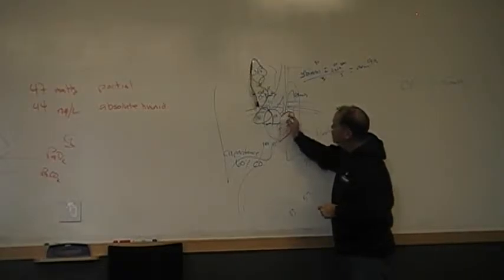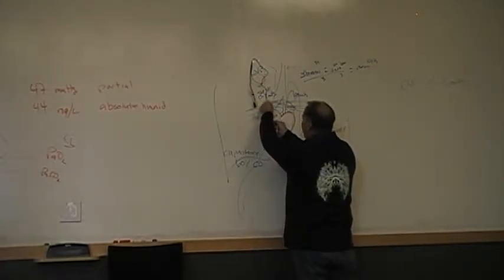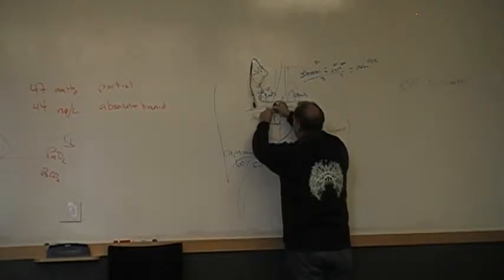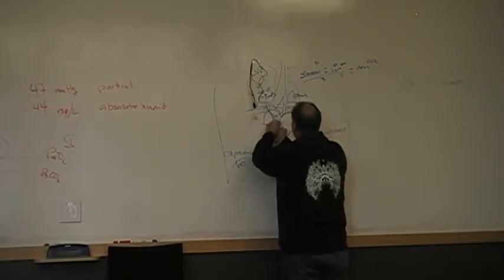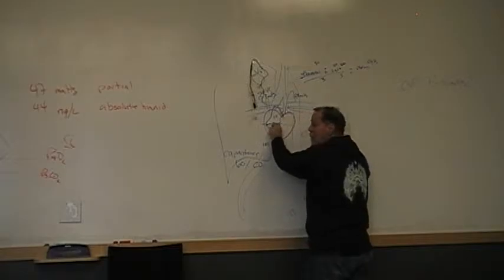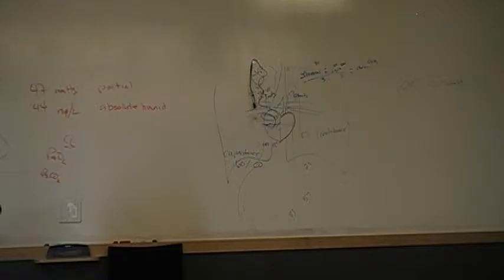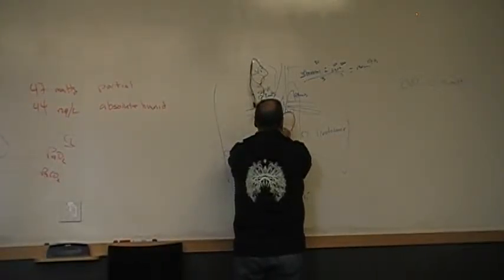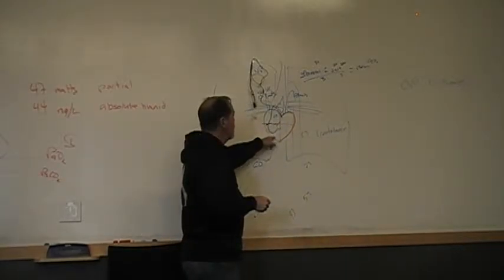Once it gets into the ventricle, however, we're going to advance the catheter. See if I can get this to work. So now we're going to advance the catheter down into the ventricle. And sometimes the normal curvature of the tube will help, but the balloon, the fact that it's flow directed, is what helps more than anything. So it goes through the tricuspid valve, it's now in the ventricle.